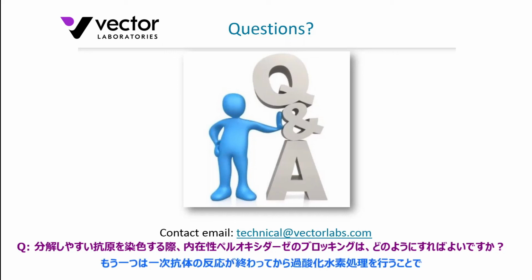Or indeed, some other investigators have done the incubation with the primary and then quenched for H2O2 after that incubation with the primary to try and avoid that lack or destruction of the target antigen. So there's a couple of options there for those investigators struggling with that application.